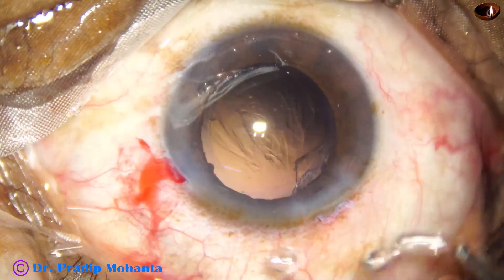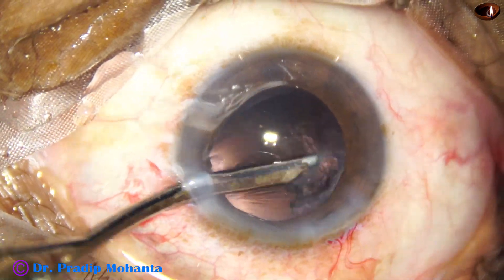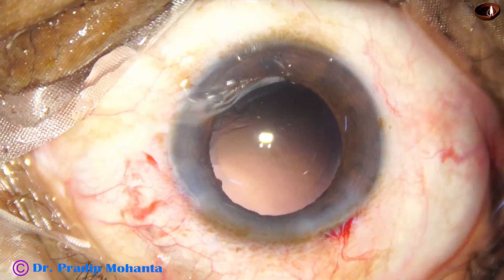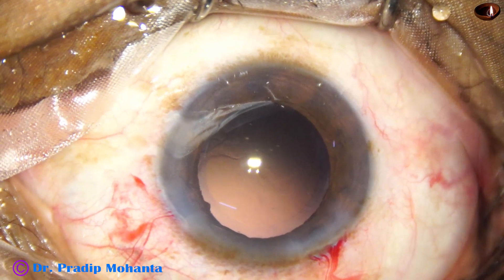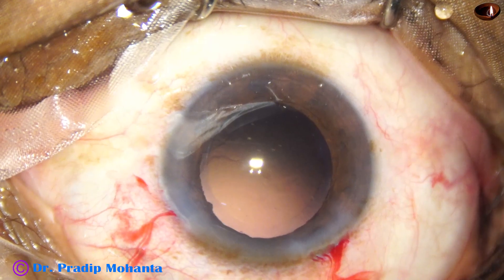Now the 23G simco is used to remove the remaining cortex — most of the cortex came out. Now is the time to implant an intraocular lens. The main wound, which is 2.8 millimeters, is enlarged.